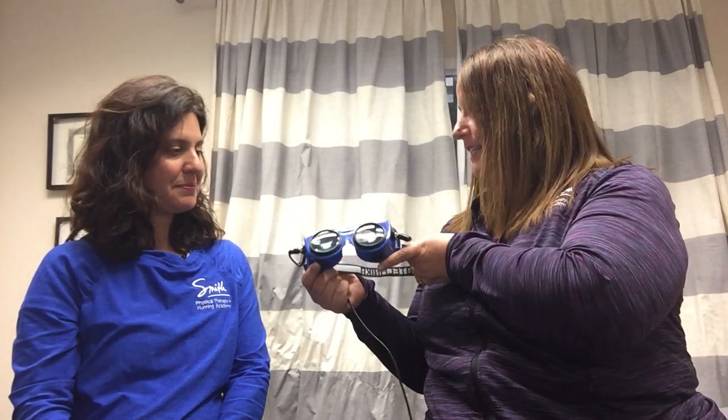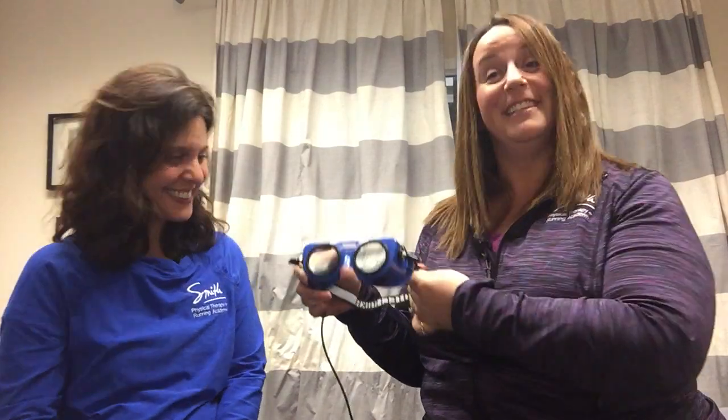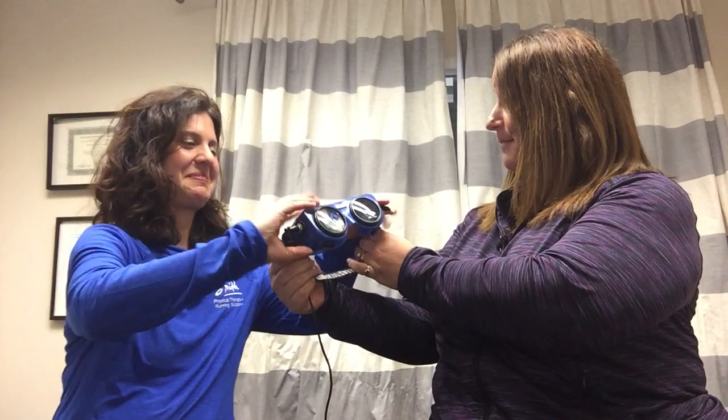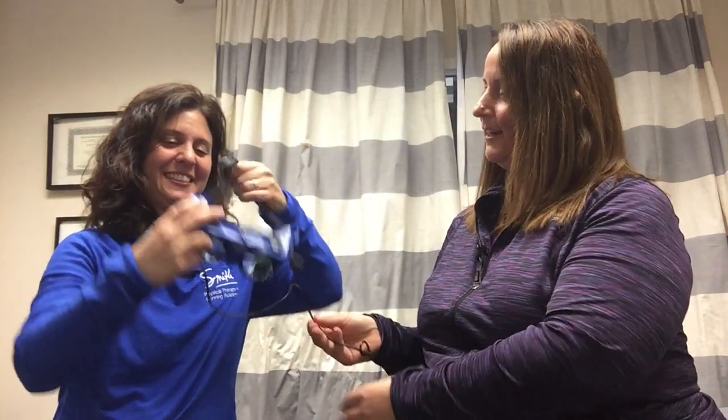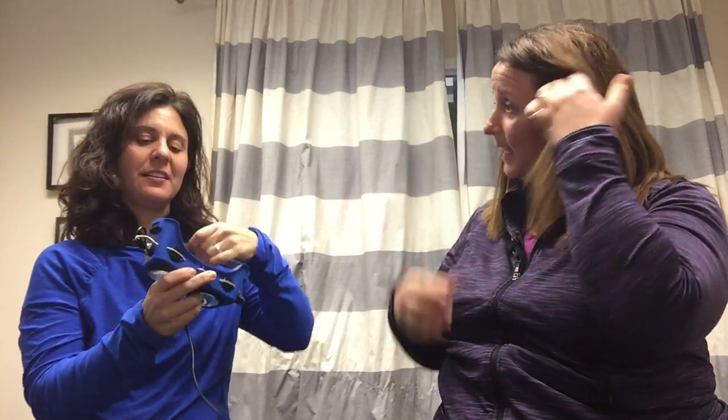And we use a tool like these Frenzel lenses, lovingly referred to as beer goggles by my friends. These help magnify the eye. You want to try them on? Sure. Oops, there you go. So you plug this into what? It's plugged into a light and the inside of them lights up, so you can see what my eyes are doing. That looks really nice. It matches your shirt. Oh, thanks.